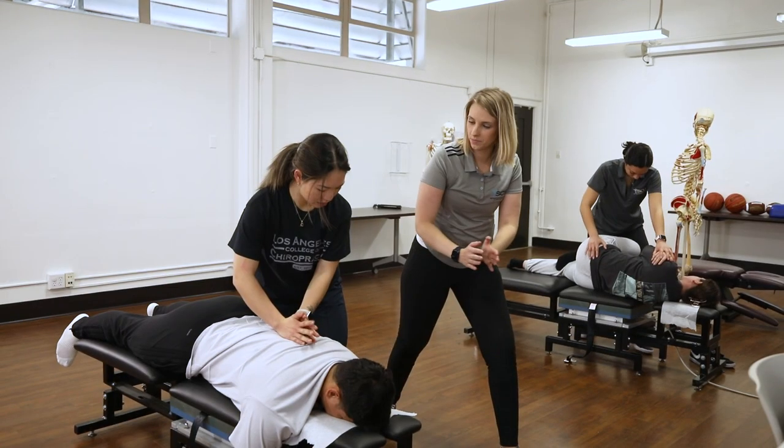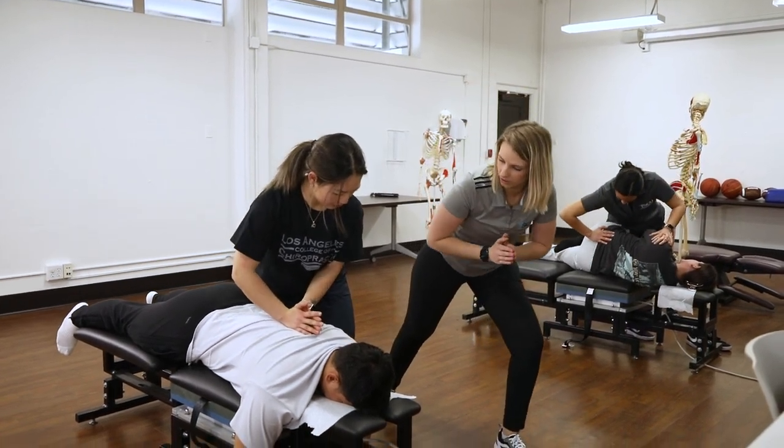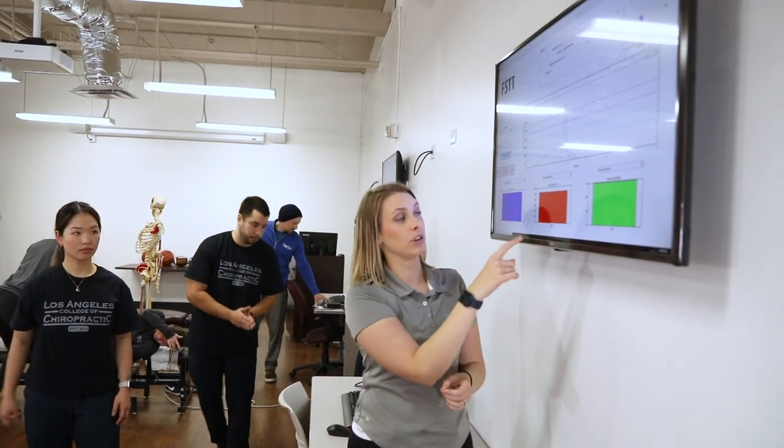So for example, if they are adjusting and they don't have enough speed, we can say this is showing that we need to work on your speed, and I can help them right then and there.